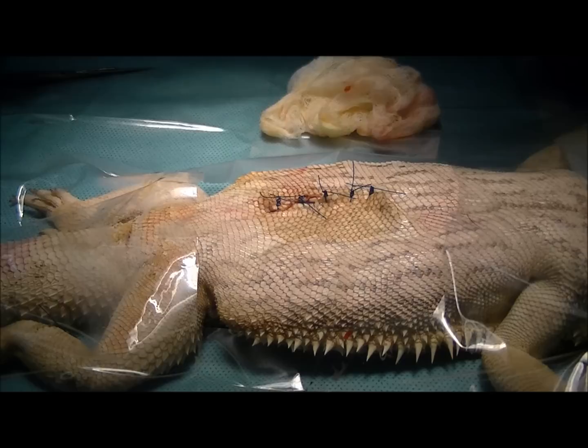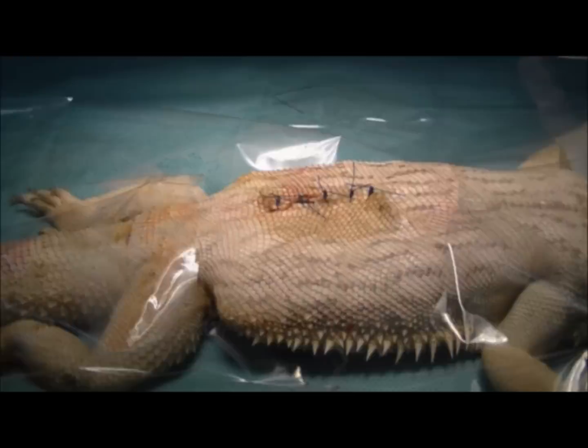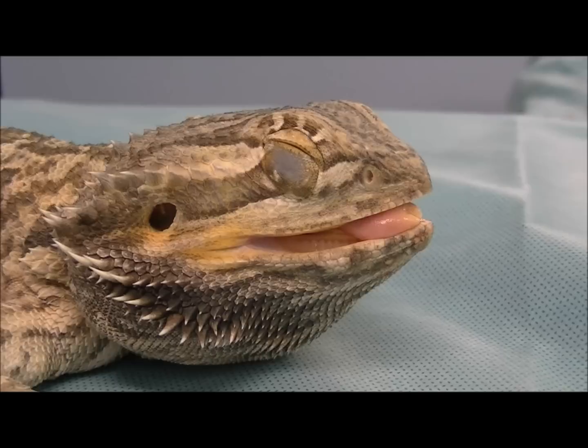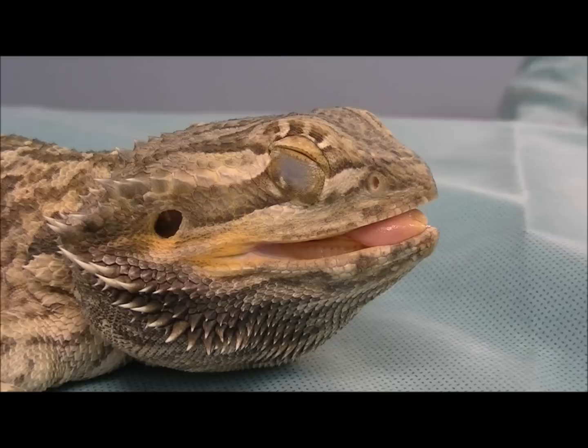And that's how you desex a dragon. We're going to let her wake up now. We'll give her some pain relief and some fluids just to help maintain her blood pressure. I expect her to make a full recovery. Here's Icy — she's woken up from the anaesthetic and has her endotracheal tube out. She's still a little worse for wear with her eyes shut and her tongue hanging out, but we'll let her wake up a bit more and she'll go home this afternoon.